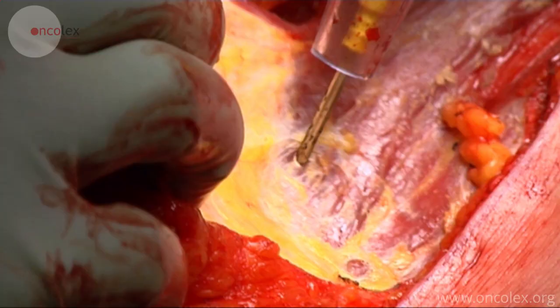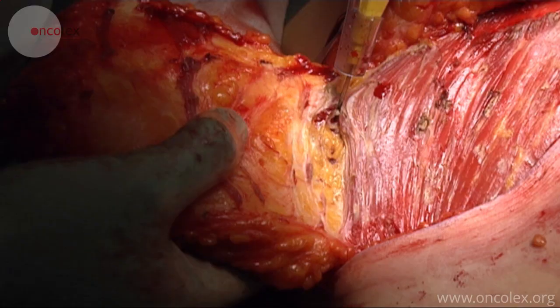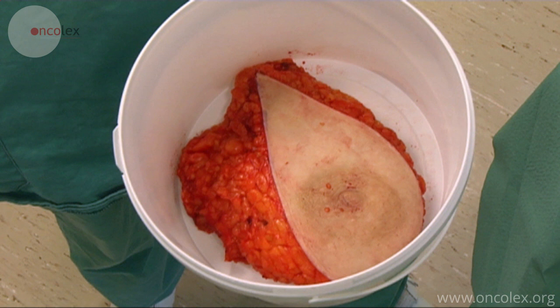The pectoralis major muscle is now exposed. The specimen is cut loose. It is marked with a suture medially and sent to the pathologist.